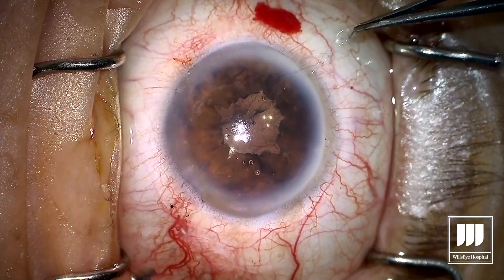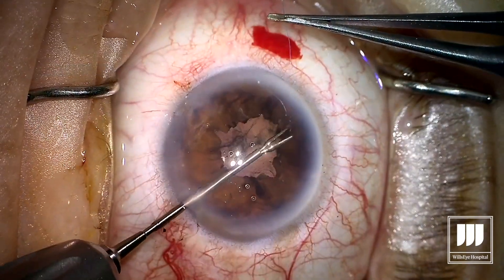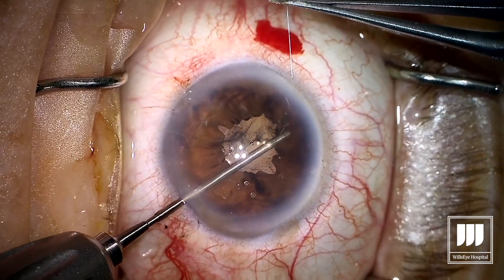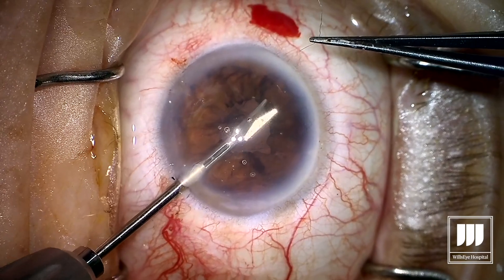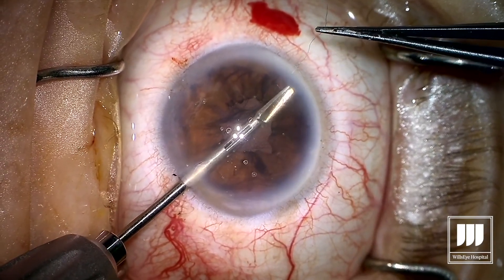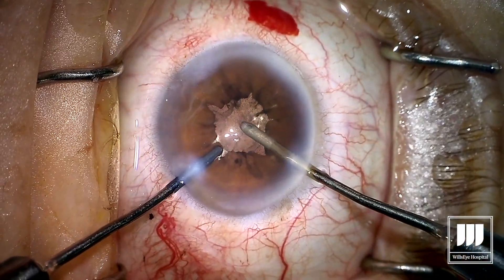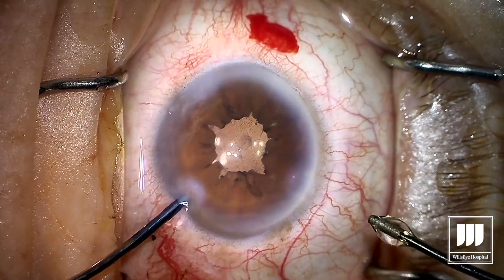The only thing to be cautious of is that on occasion, that second throw will still allow a little constriction of the pupil. Once the suture is tied and you're happy with the pupil size, you'll end up cutting the ends of the suture using an intraocular scissor. You'll then need to remove the viscoelastic — in this case, I'm going to use a bimanual IA. But the suture is completed, so I hope you've understood and can now go back and tie your McAhmad knot.